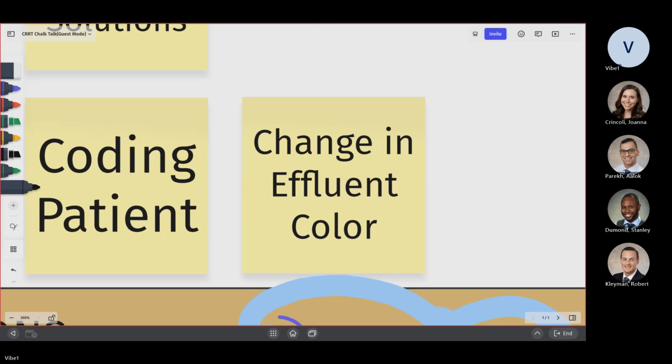You have to check it out because that means there is a breach in the filter. That means the dialysate and the blood are coming in contact with each other. You can always analyze the effluent fluid and send it to the lab as a body fluid and have them look for red blood cells, because they shouldn't be in the effluent fluid.